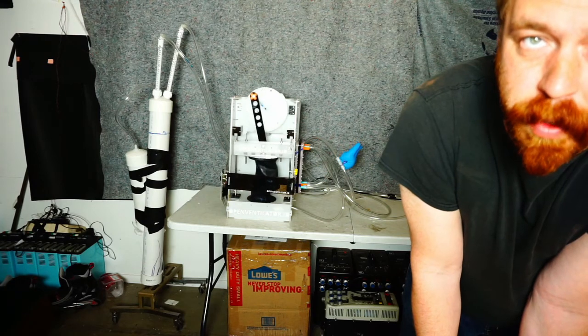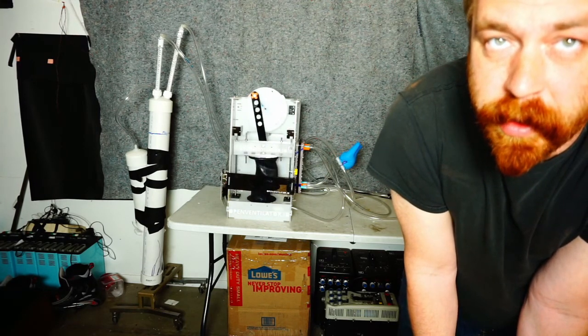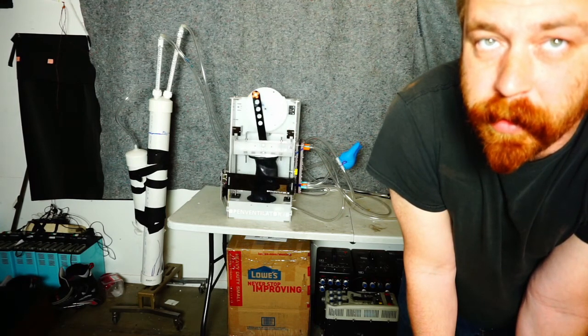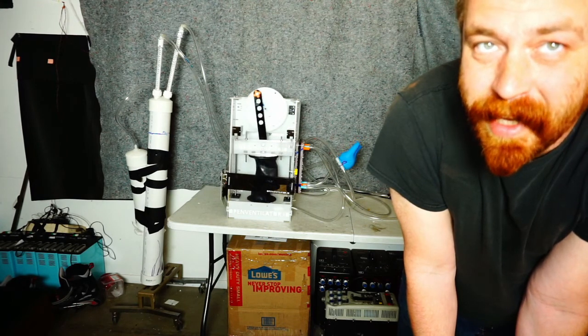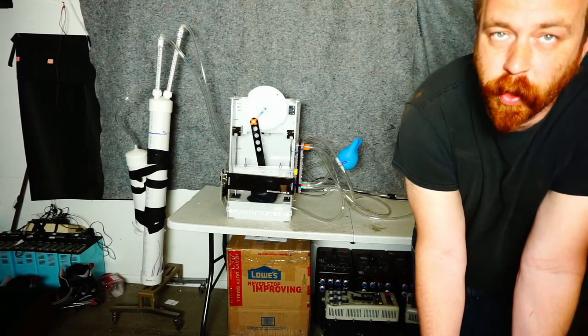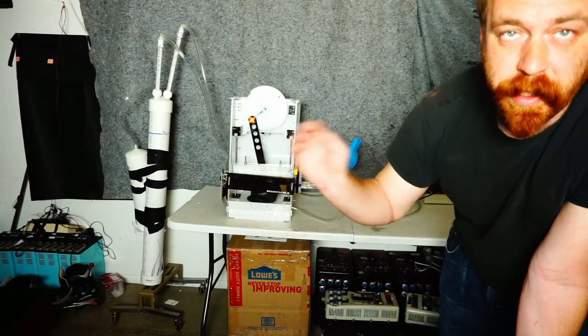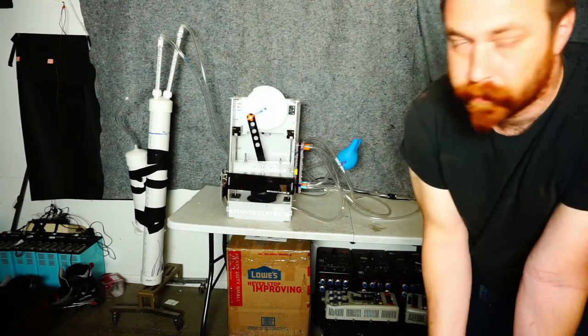You can hear the PEEP bubbling on the exhale stroke, so if we listen carefully, bubble, bubble, bubble, bubble. Bubble, bubble, bubble, bubble. And so you can see that it's bubbling only while the pump is inhaling and the patient is exhaling, and that's going out through the PEEP tube over there.